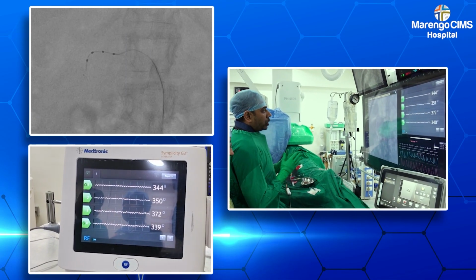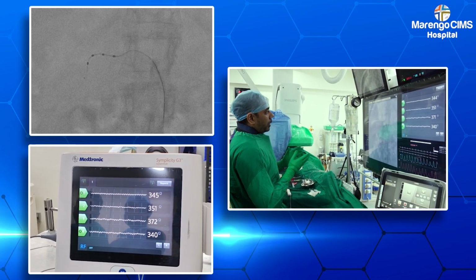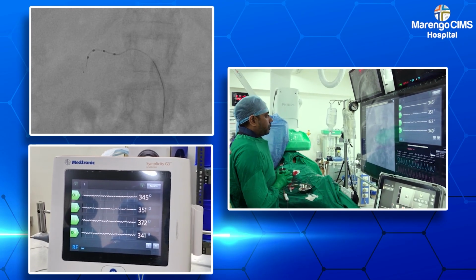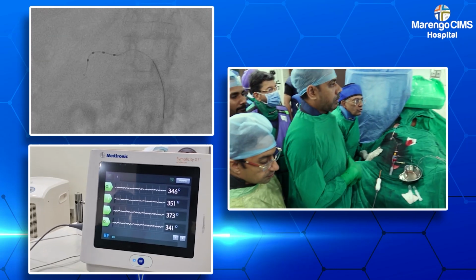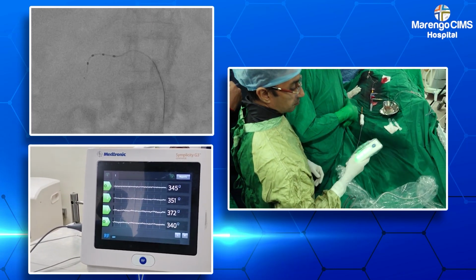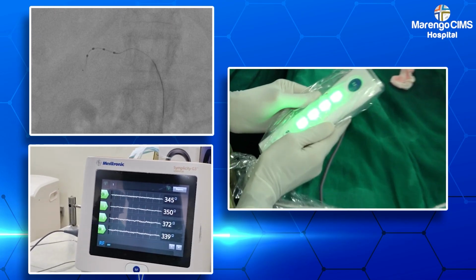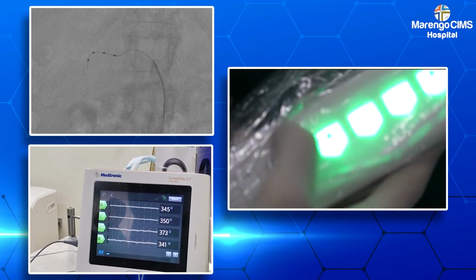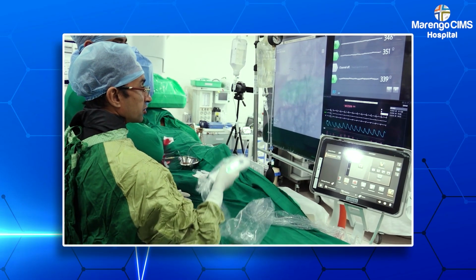So we may plan to switch off the third and the fourth electrode because it will be overlapped later on when we withdraw the catheter and again deliver the radiofrequency ablation. Overlapping has to be avoided. Vipul, why don't you turn off channel 3 and channel 4, show them, and then initiate the first ablation. Right. As you can see on this remote control, there are 4 buttons. If I press this button, you can see the third one is switched off.